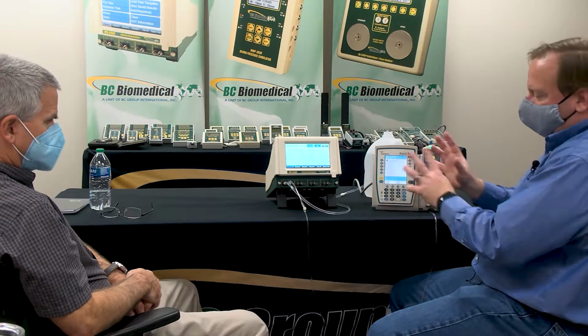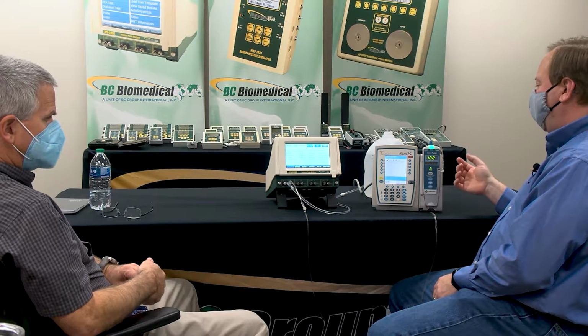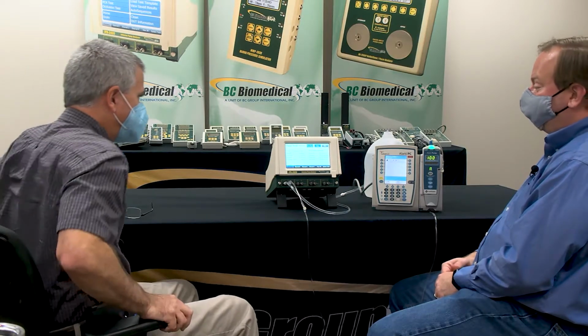And then you did all the priming ahead of time. Yes, I already primed, it was ready to go. Except for when it said there was an air bubble that I can't see. Yeah, I was watching, I never saw one come through, but it's very sensitive, and as it should be, because if you start injecting air into your patient, that's bad. Not good. It's real bad.